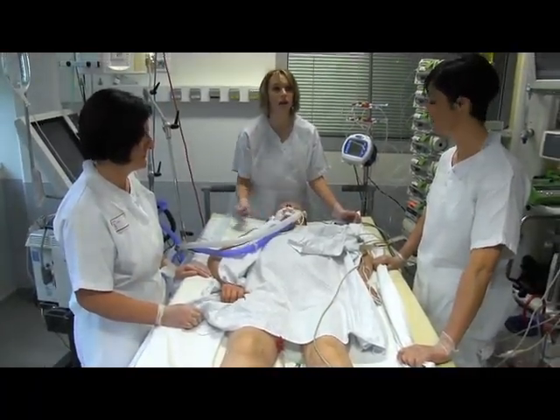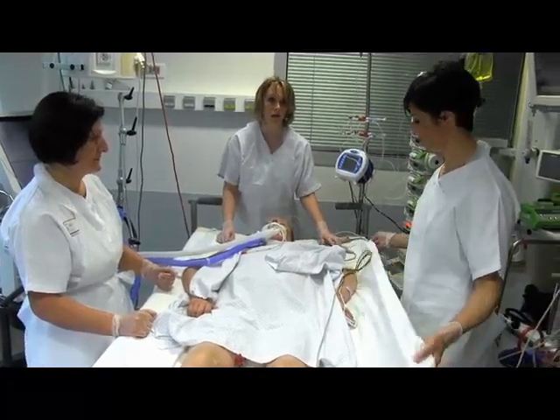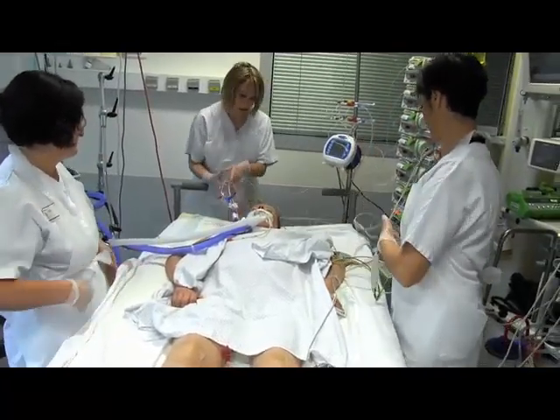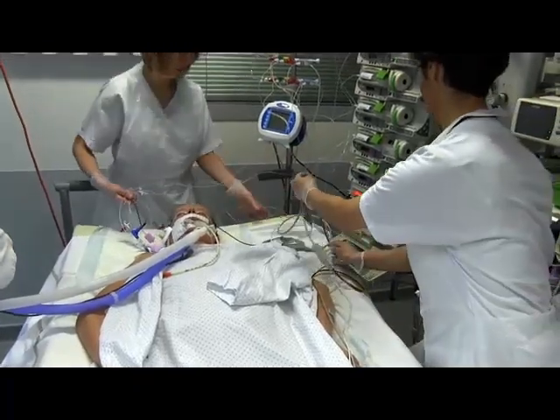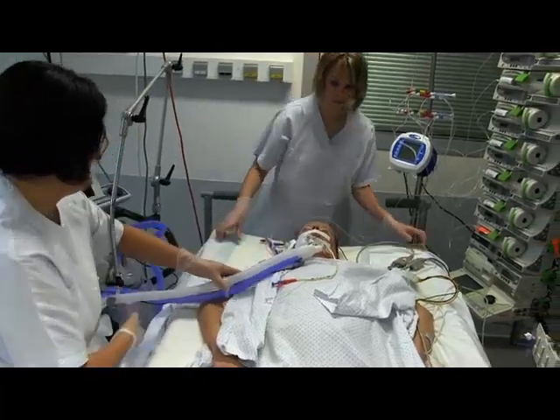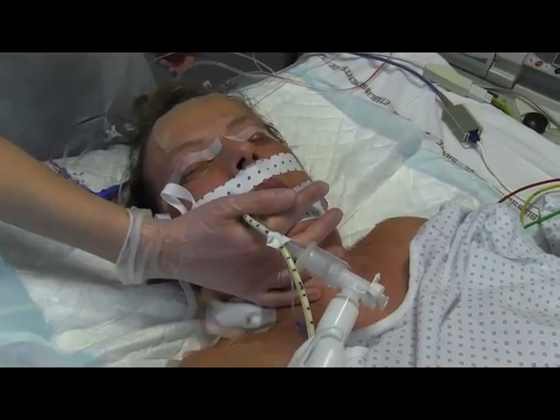The procedure is performed following five steps. The first step is to prepare the procedure. At this stage, you have to decide which direction to turn the patient — to the left or to the right. Priority is given to whichever side the central venous lines are located. Check the length of the vascular lines and the transcutaneous saturation cable to be sure they are long enough. Move the ventilator as close to the patient as possible. Check the patient's hemodynamic status and the level of sedation. Secure the endotracheal tube and the gastric tube.